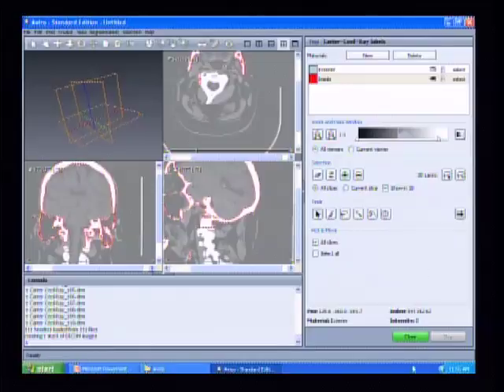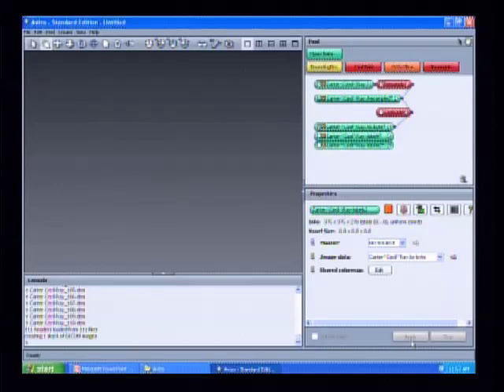I'm assuming that you guys are not going to want to finish these when we come back from lunch, because we're just going to move on. So if you get to an end point of where you are now, we're just going to close out where your current segmentation stands, and we're going to make a 3-dimensional model of it just to finish up the process of how you would do this. So once you're at a point where you can stop, you just go ahead and hit close, and it'll take you back to this main user interface.